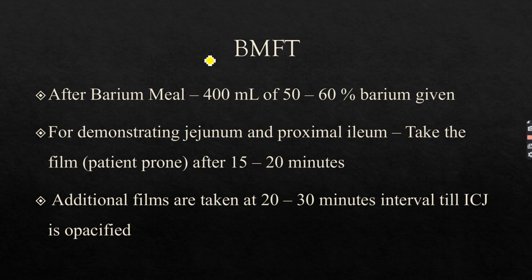After the barium meal, 50 to 60% barium, the volume around 400 ml, should be given to the patient for BMFT. And after 15 to 20 minutes, we are supposed to take the film in the patient prone position if we want to demonstrate the jejunum and proximal ileum. Let's say the upper half of the small intestine, if we want to demonstrate it, take the film after 15 to 20 minutes.